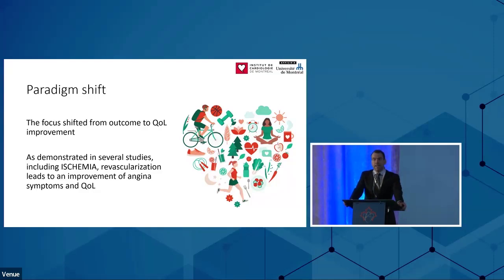So in that sense, myocardial perfusion imaging is still very relevant because you still need to identify those patients that have flow-limiting lesions who would benefit in terms of symptoms of revascularization. The patients we're seeing now have multiple stenoses. Which one is critical? Which one is the culprit? How many should we revascularize? So myocardial perfusion imaging is still very, very relevant to answer these questions and to have complete revascularization in these patients.